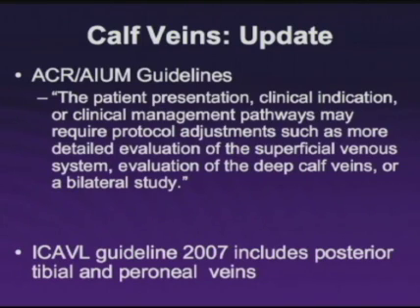The ICAVL, which is the Intersocietal Commission for the Accreditation of Vascular Laboratories, in their recent guidelines includes evaluation of the posterior tibial and peroneal veins as part of their guidelines for accreditation.